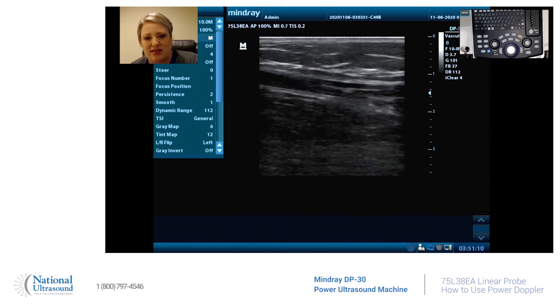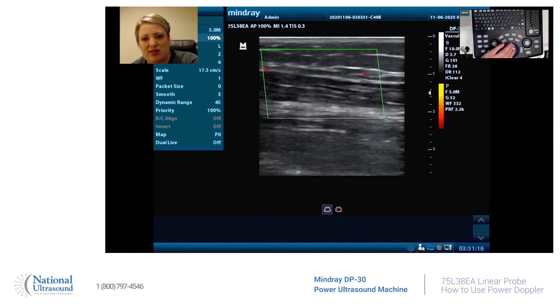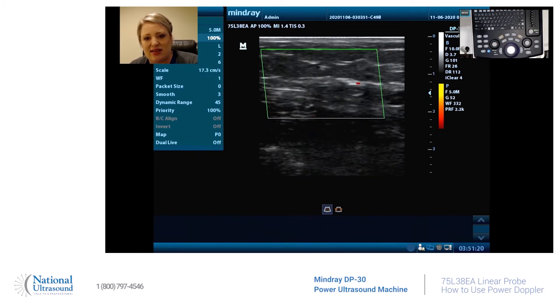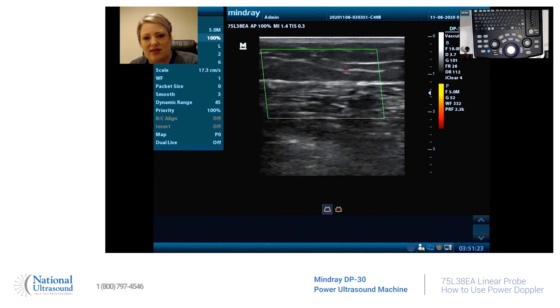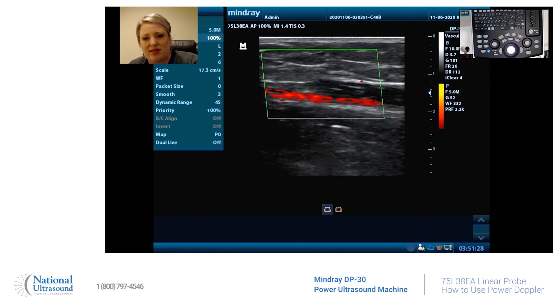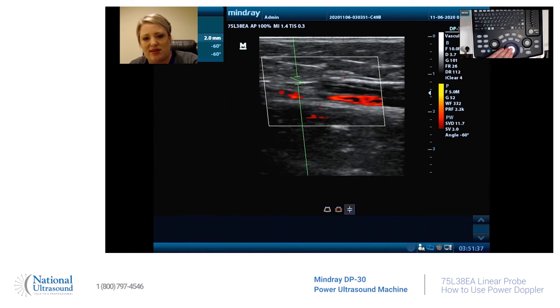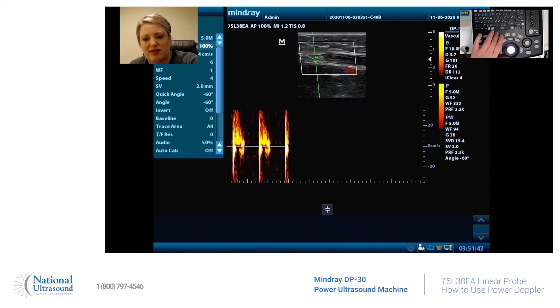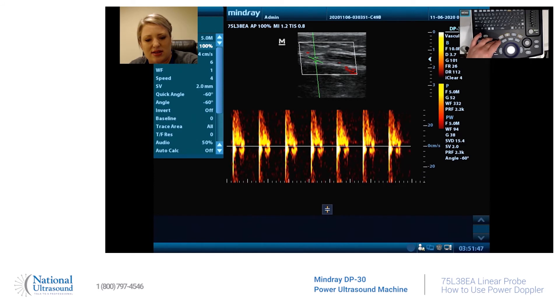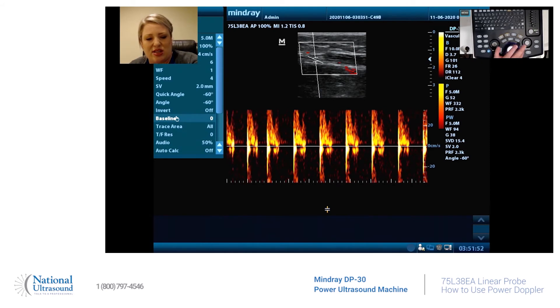I'm going to hit B to take us out of all these modalities, and then I'm going to put power Doppler on to be able to view it. There it is. Now pulse wave — and hit update.